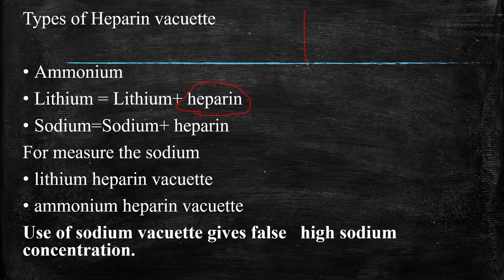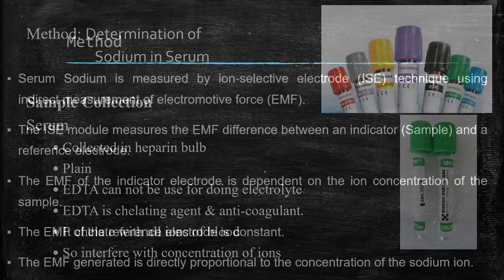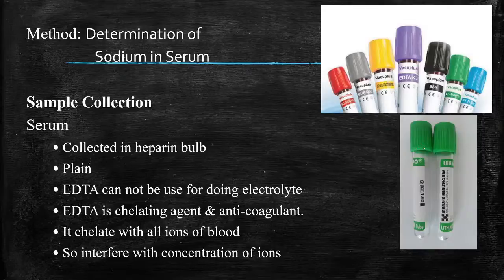Okay, so the sample holders that are used are called vacutainers. Vacutainers you have seen in labs, they are used to draw blood. So why are they called that? Because they create a vacuum. So at the top of the lid, there will be space to inject, and there will be a self-sealing rubber. So that will be part of this lid.